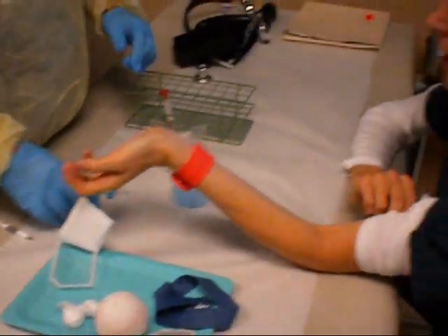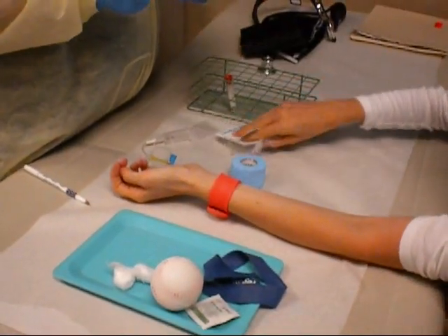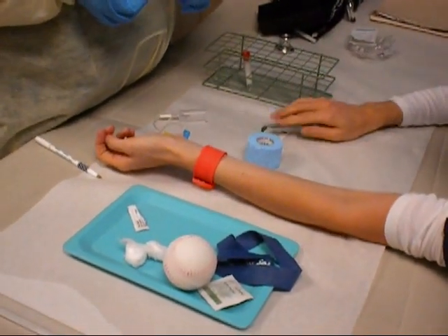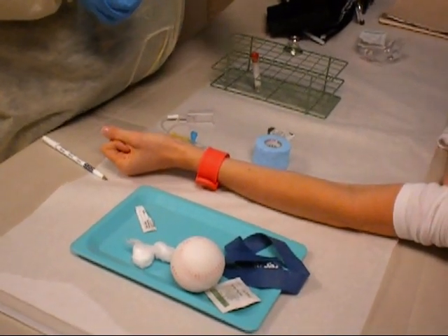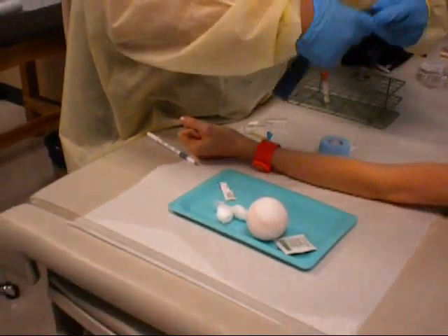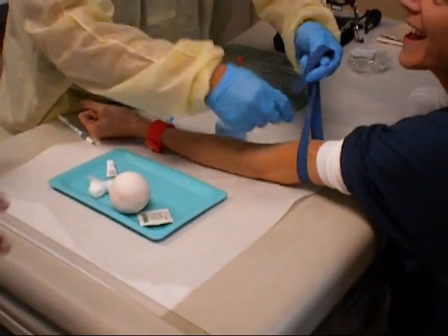So what we're going to do is we're going to clean up. Have you found your veins first? No. So first you have to find where the vein is. So you can take your little alcohol swab and set it on — just set it right here. Now you're going to put the tourniquet on the arm. Hey Melvin, you're clear here — this is just first, like, doing anything in here.